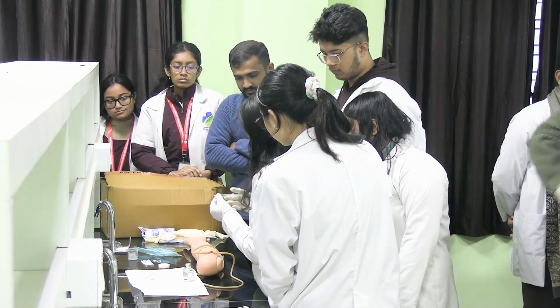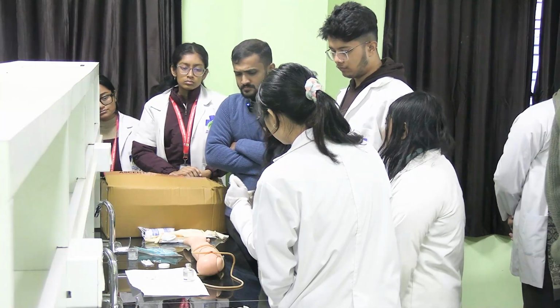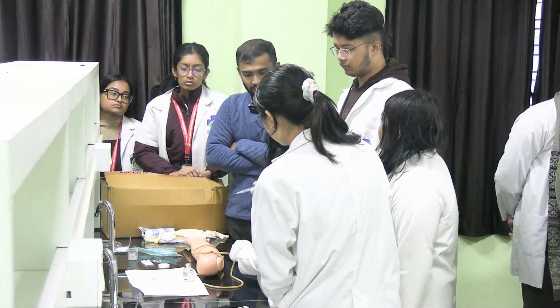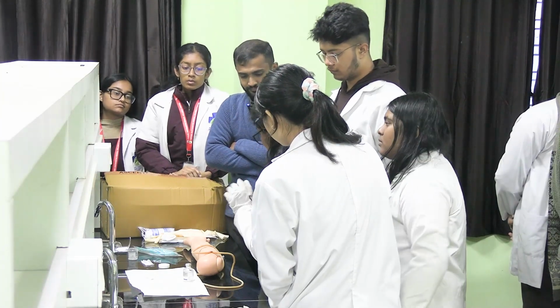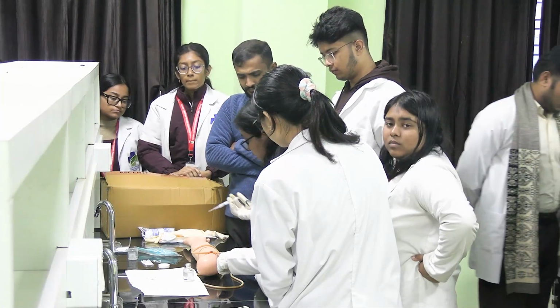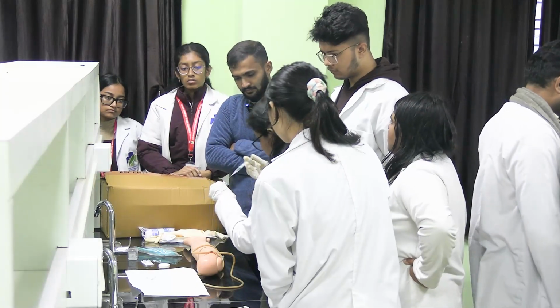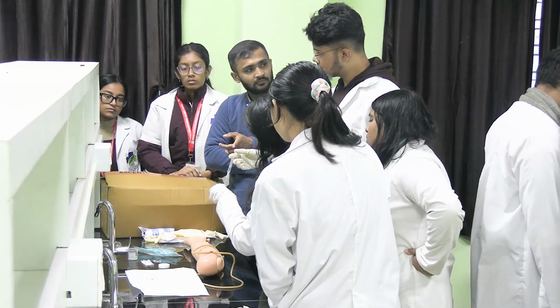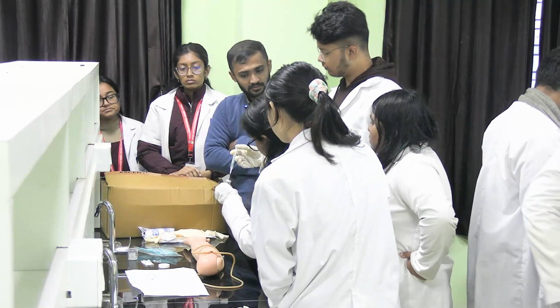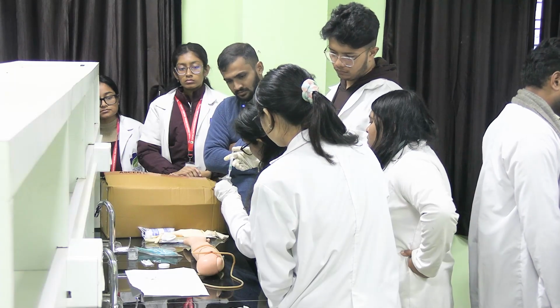What are the things you'll be seeing in the syringe? Before that, you have to check the plunger, whether it is working or not. If I want to take 1 ml, I will take an extra, 1.1 ml. After that, I'll put the needle inside the rubber cap. Only in case of a vial, you have to inject the air as much as you'll be drawing.